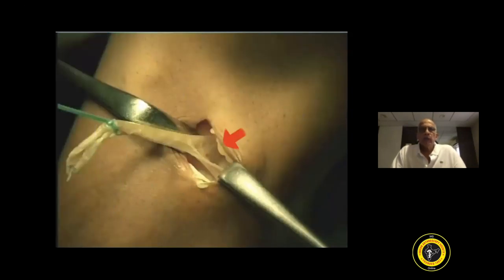In this video, we are showing harvesting of the hamstring graft. When you harvest the hamstrings, make sure that you lyse the dense bands — aberrant bands which run between the semitendinosus and the medial head of the gastrocnemius. If you do not lyse these, you may end up with a short, amputated graft.